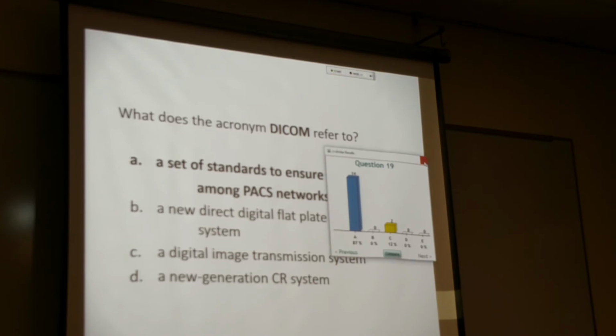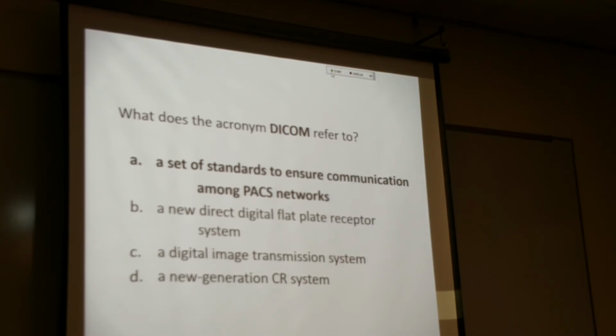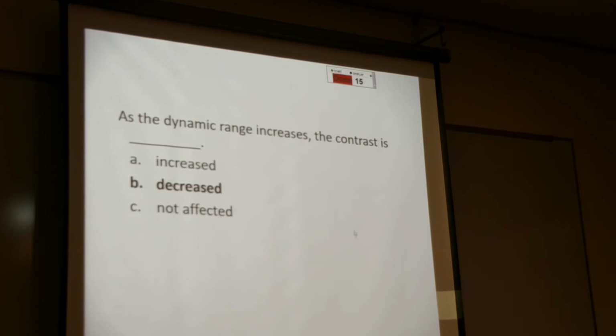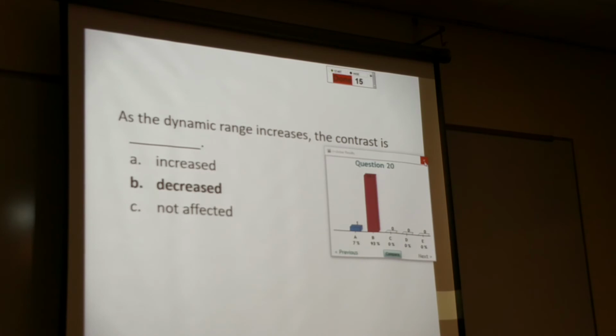Make sure you know your terminology, DICOM versus PACS. Oh, did I just have that one? Yeah. Okay, then hopefully you get it. See how your learning curve is, okay, almost.